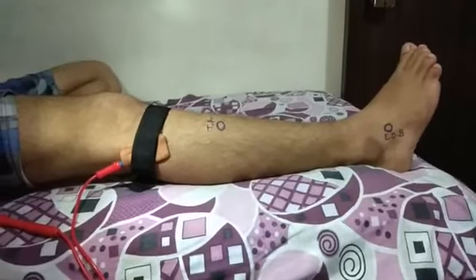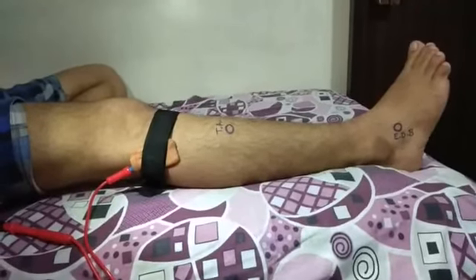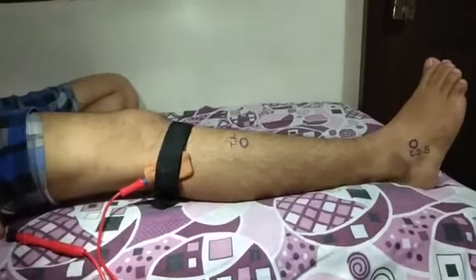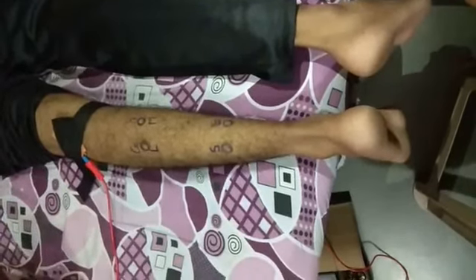Deep peroneal nerve, which supplies 5 muscles: tibialis anterior, extensor digitorum longus, extensor hallucis longus, extensor digitorum brevis and peroneus tertius. The reference electrode we can place at the lateral side of the head of the fibula for the common peroneal nerve. Tibial nerve, which supplies tibialis posterior, flexor digitorum longus, flexor hallucis longus, gastrocnemius and soleus. For the tibial nerve, we can put the reference electrode on the popliteal fossa.